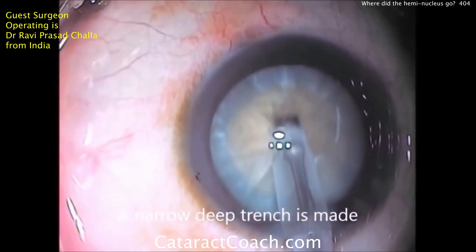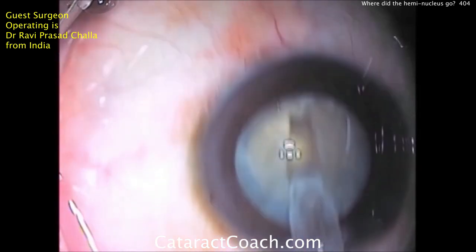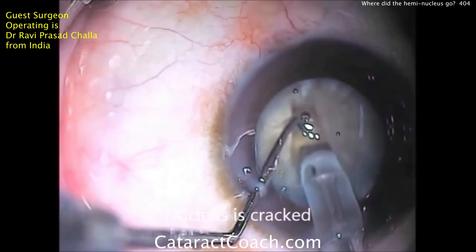Sculpting a central groove now for a stop-and-chop type procedure. Everything looks pretty routine in this case. Nice, good central groove, and then going to crack this and split it into two halves.